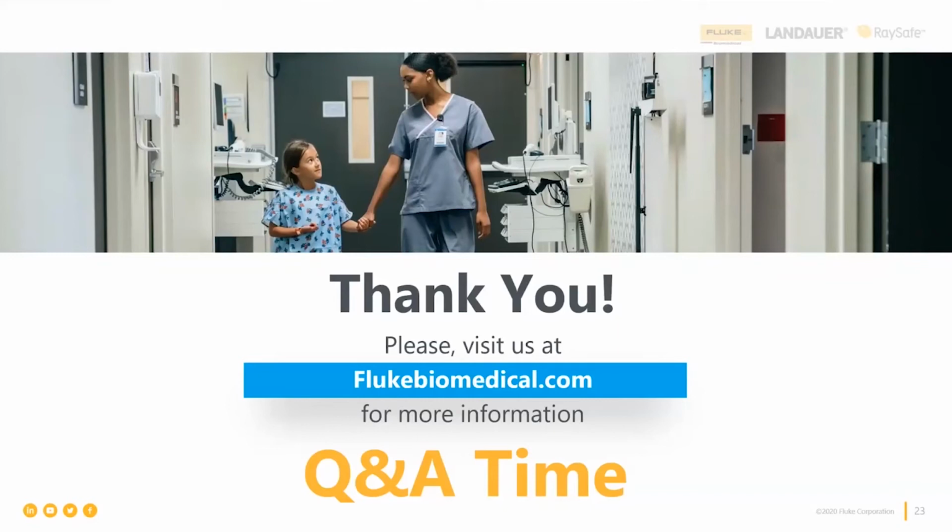So the enclosure is not metal, and there is typically no metal test point that is non-earth. So the way the standard describes this test is your test point is a non-grounded conductive test point on the surface of a medical device, defibrillator in this case, that the patient may be able to touch, or that the caregiver, the clinician, may be able to touch while also touching the patient. That's the definition. Well, if it's completely enclosed in plastic, you don't have any conductive test point.